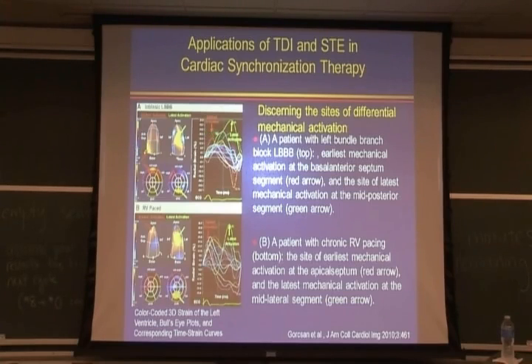So there is a difference between the wall deformation, and there is a marked dysynchrony between the earliest and the latest mechanical activation. This provides the degree and amplitude of the mechanical dysynchrony, by measuring the time difference and how many segments are dysynchronous and where exactly they are. So this is a left bundle branch block patient with dysynchrony.